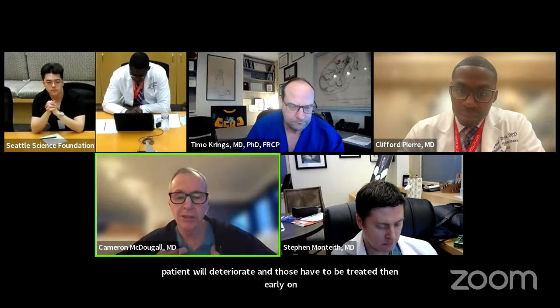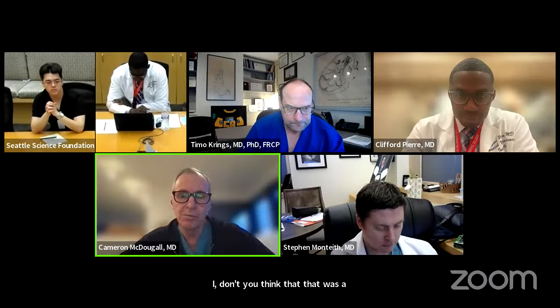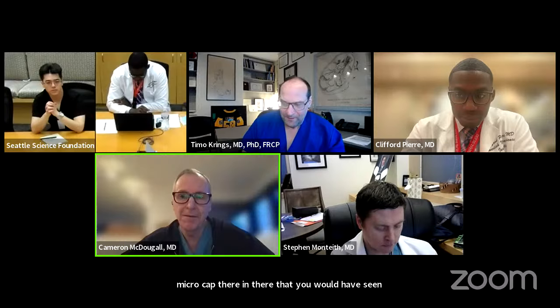And the last thing I want to check with you on is that case you showed, with the anterior and posterior spinal arteries coming out of the same level, that sort of changed your practice. Don't you think that was a segmental artery injection? Don't you think that had you gone and put a microcatheter in there, you would have seen the posterior spinal artery?